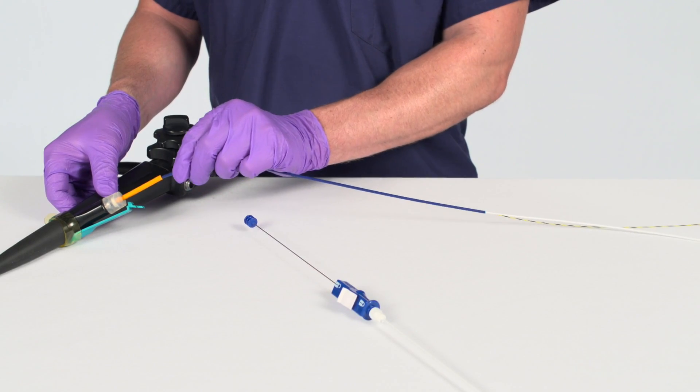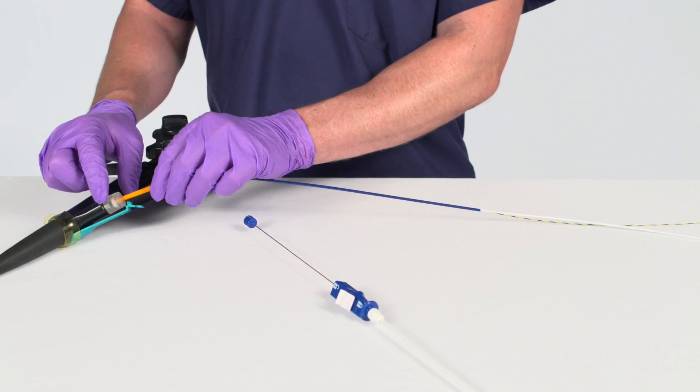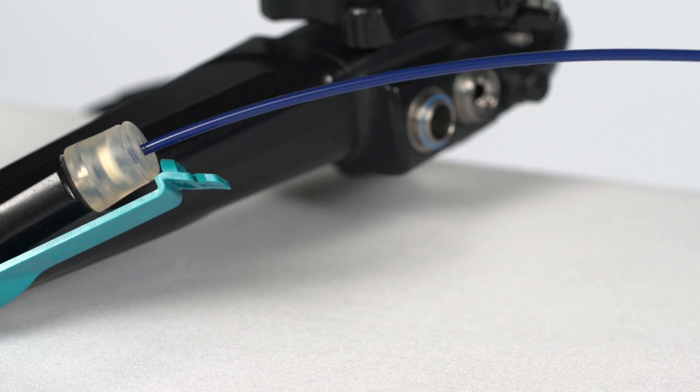Once the trailing barbs have been introduced into the biopsy cap, slide the stent barb flap cover back and out of the way.